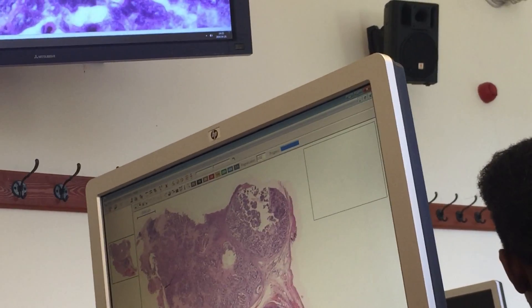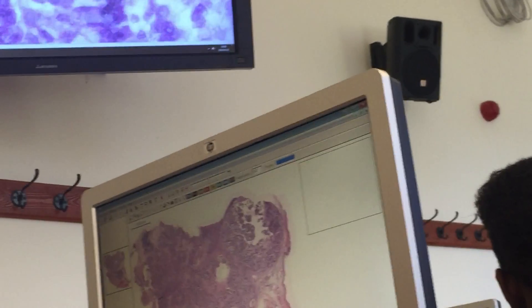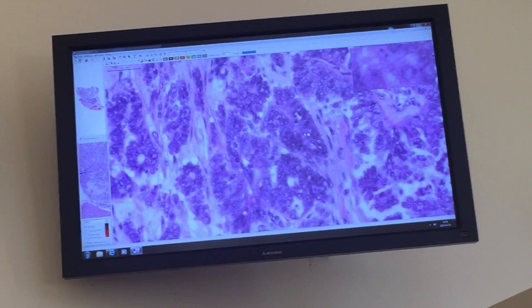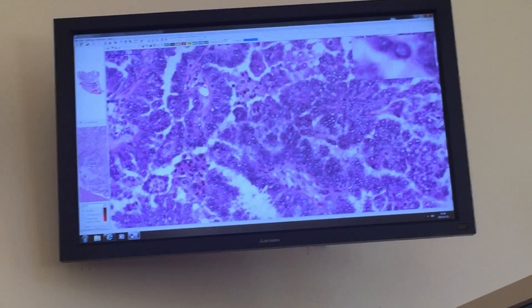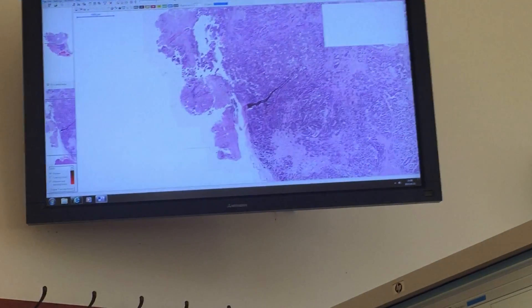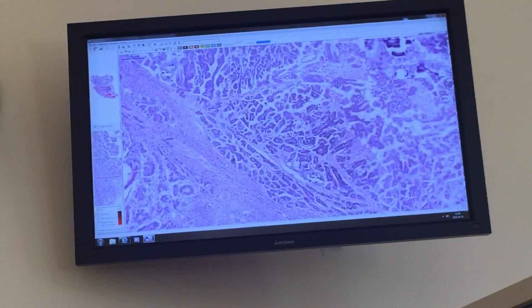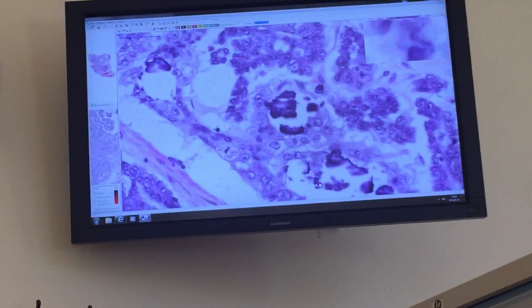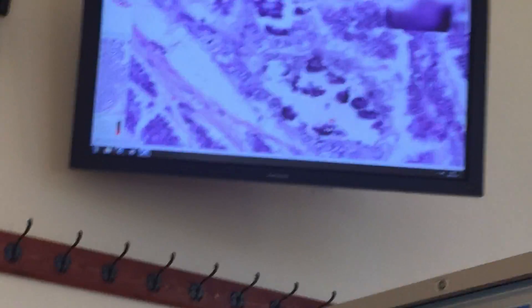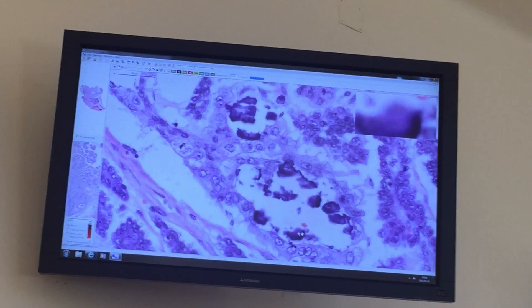Usually there are so many cells in the papillae. And then when I go further, there are neutrophils and necrosis. And here you will see the remaining psammoma body — so even in this you will already see psammoma body.